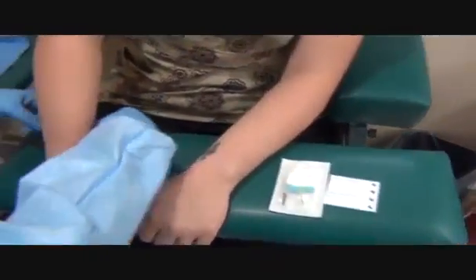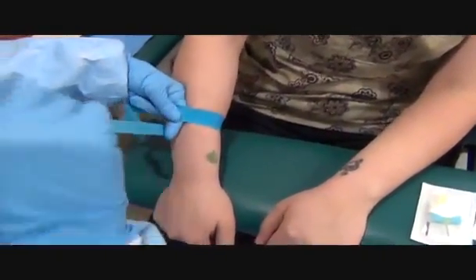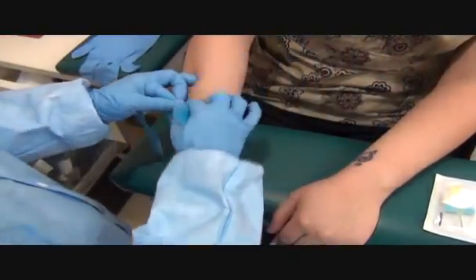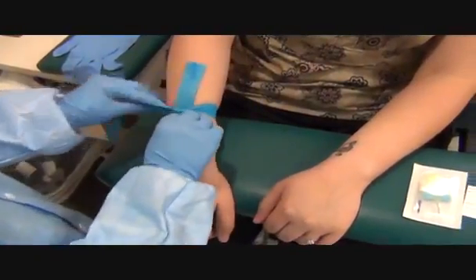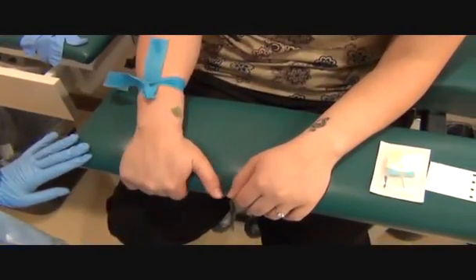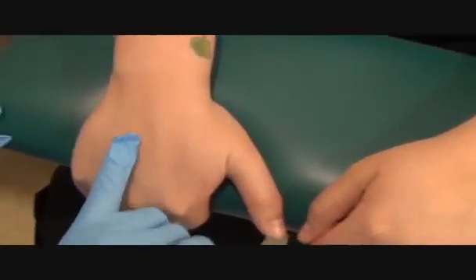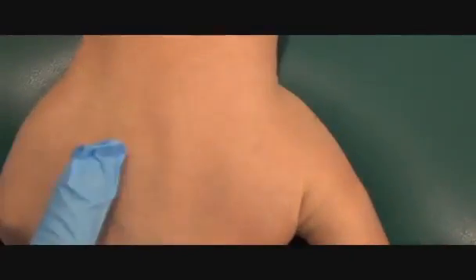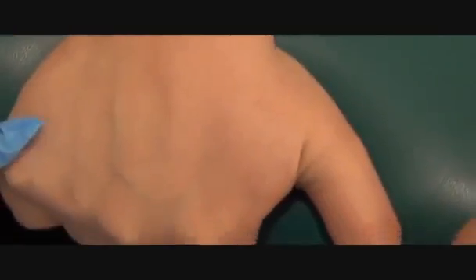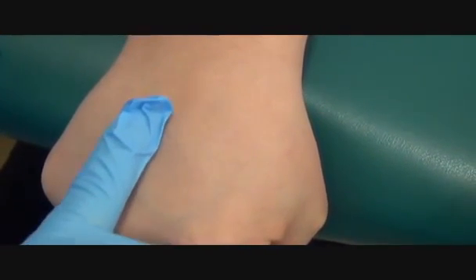I'm going to take a look. I'm still going to tie the tourniquet four inches above the site regardless of the location. So because I'm going in her hand, I'm going to tie it four inches above her hand. Please grab onto the chair. There are three different ways you can make a vein pop up. You can ask the patient to grab onto the chair as I did. Will you please make a fist? You can have them make a fist. This makes the vein a little fatter.